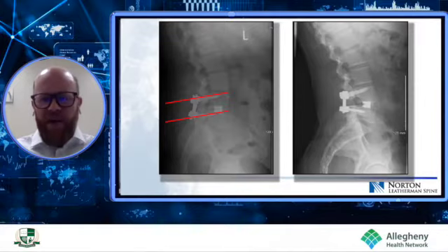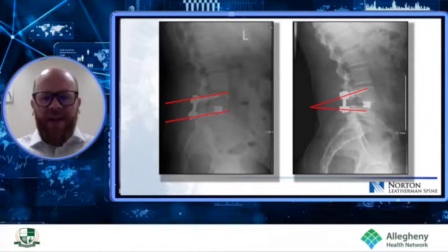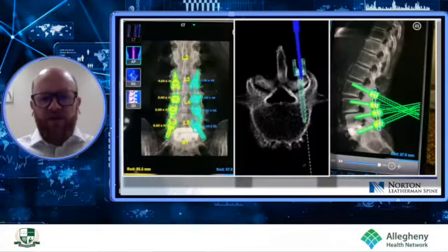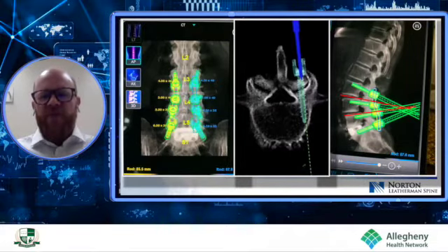You're going to prep it, pack it with graft anyway. But this is a modified construct on the right, so it allows us to really optimize that incision. Here's a planning image, right? Left is coronal, right sagittal, obviously. And that image in the center shows that mid-construct to distal construct screw where it can violate that facet. You're prepping it, you're fusing it. It doesn't look like that when you put the screw in, but you're able to do that and really converge everything on the skin. So it allows you to optimize that skin incision.